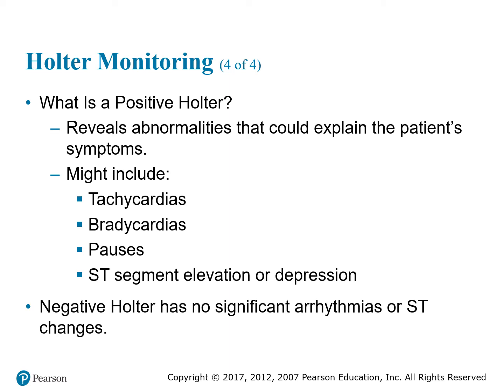The patient should also know how the monitoring equipment works and be instructed to check that it is working properly during the procedure, because we're not going to be with them. It's their responsibility to make sure that the battery is working. We check to make sure the battery and everything is fully charged, but anything can happen. It is an electrical device. Technical difficulties do happen. So we have to make sure we instruct the patient on properly taking care of their Holter monitor while it's on them.